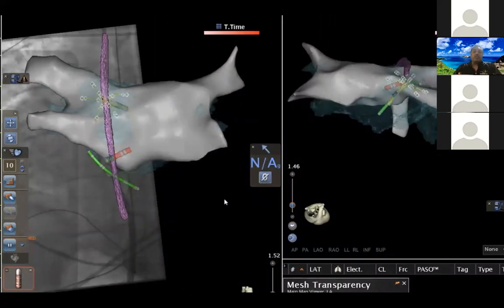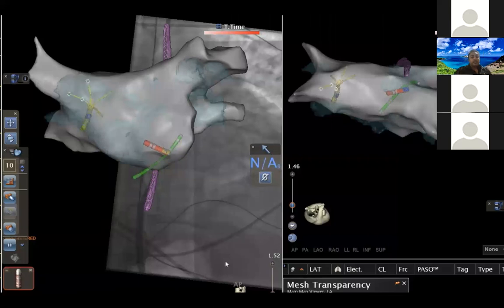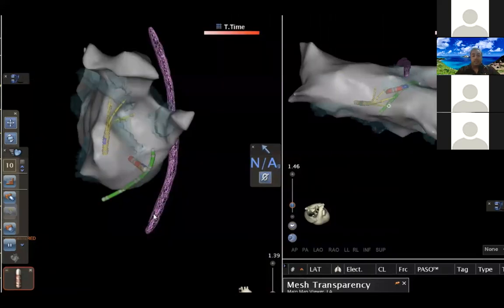Okay, so once you do the transseptal, honestly, the rest is really quite easy. Some of us aren't getting CTs or pre-imaging anymore. I think the fidelity of the maps that we create is so good that you don't really need to worry too much, you can ablate right on top of your map. But taking the time to do a good map is really, really critical.